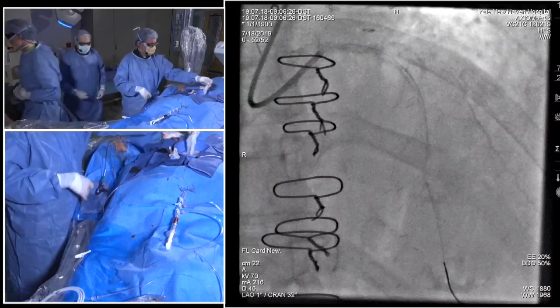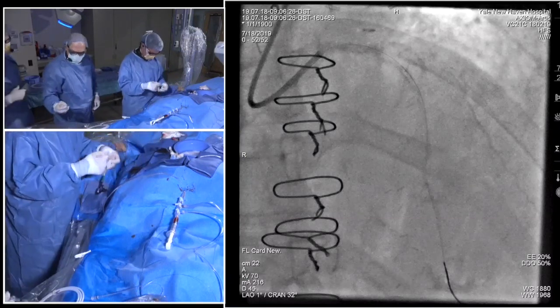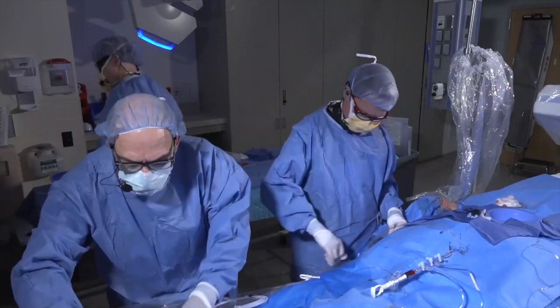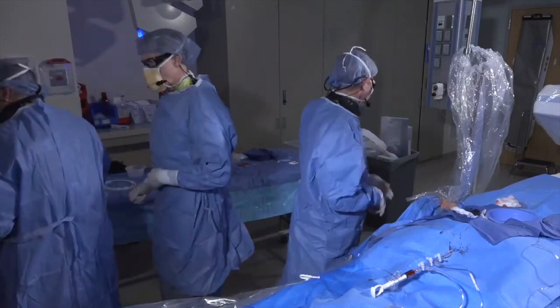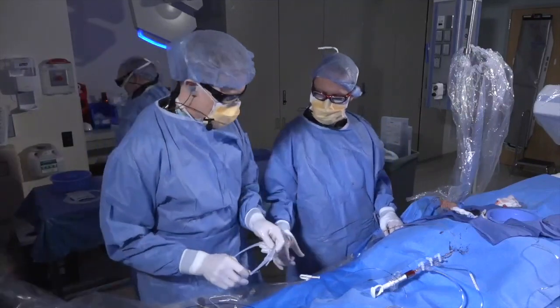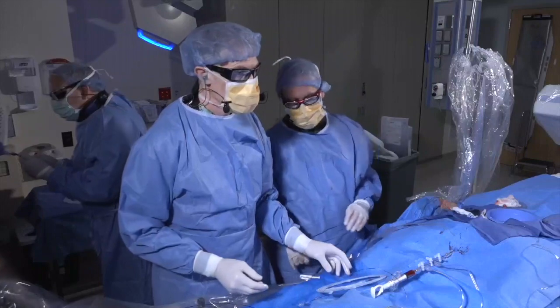I think the other point just about the imaging catheter, this case is obvious. There's a lot of calcium. But there are cases where you're not sure. And risk factors for severe calcification are things like post-CABG, this patient has it, severe renal disease, this patient doesn't have it, elderly age, and you really have to have your spidey sense about this. And if you start having those risk factors, then you're still on the fence.